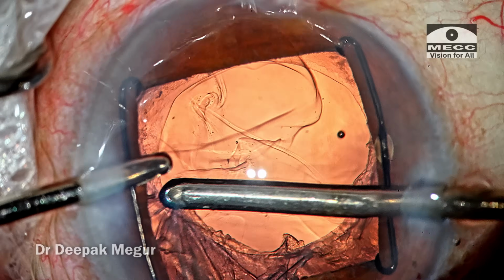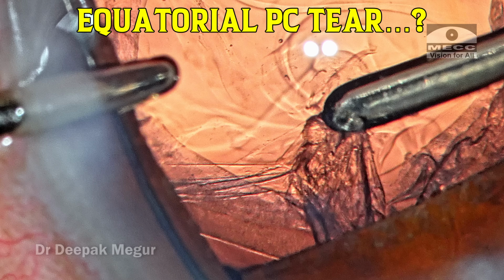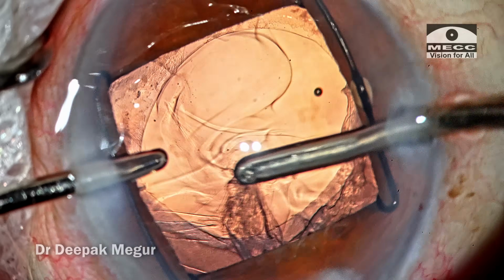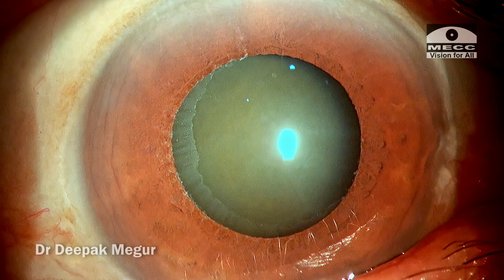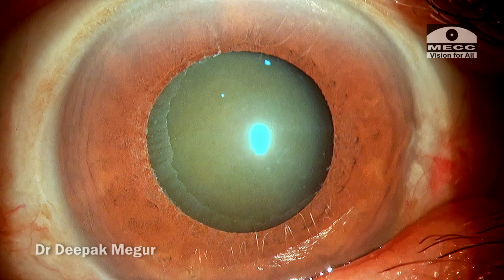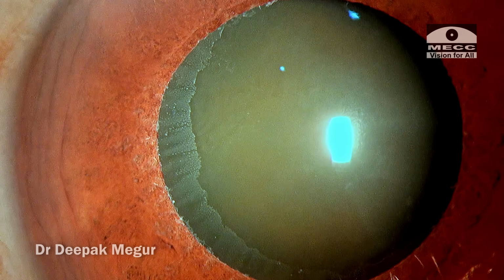Hello friends, sometimes differentiating between equatorial posterior capsule tear and a zonular weakness can be a challenge. I had one such encounter in this case, and let's try to dive in deep and analyze it. So this is a 75-year-old gentleman, and as I keep telling, pseudoexfoliation is an extremely common condition and I encounter them on a daily basis, and it is so common in my practice.